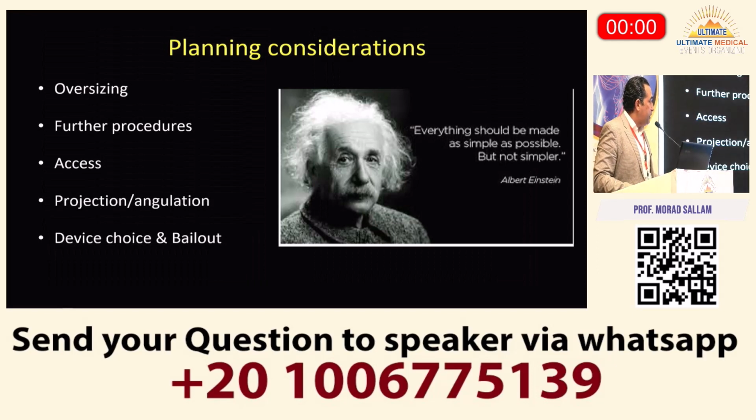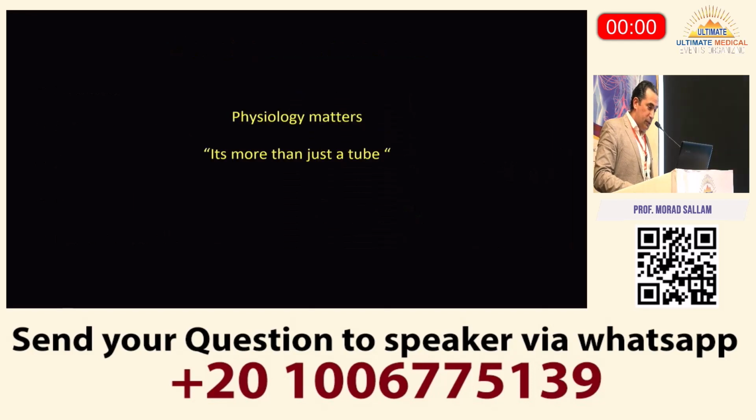Finally, there's a lot here about planning that needs to be kept in mind. The oversizing depending on the pathology, any future procedures, the access, projection and angulation, especially for steep arch, and the device choice and bailout all need to be considered. The last thing I would like to say about TEVARs here is that physiology matters.